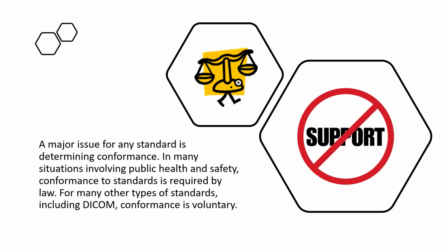A major issue for any standard is determining conformance. In many situations involving public health and safety, conformance to standards is required by law. For many other types of standards, including DICOM, the conformance is voluntary. The DICOM interfaces and what the CT scan or other modality can do may differ between manufacturers because, remember, conformance to DICOM is voluntary.